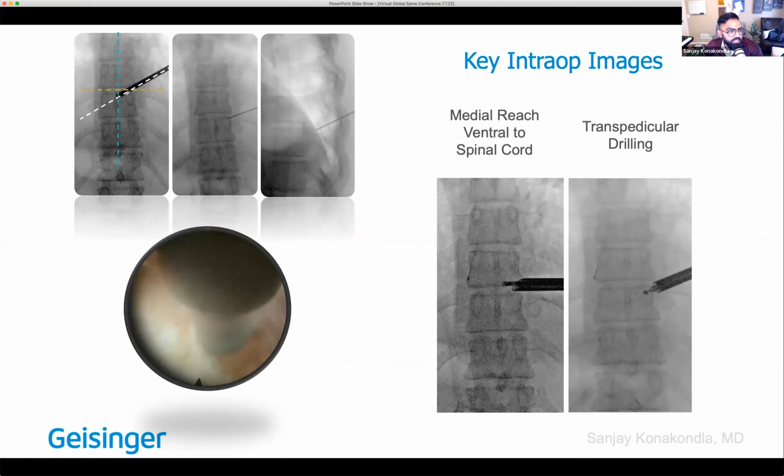And these are the key intraoperative pictures of the case. I always do these markings on the patient, midline, and the level of interest, but also the trajectories. So we get the needle in there, and you can see it's not a transforaminal or typical transforaminal trajectory. This is the SAP going up. This is the pedicle. So we're docking sort of lateral to that pedicle, because if we continue in that trajectory, we're going to get to that caudally migrated big disc that's sitting right there.